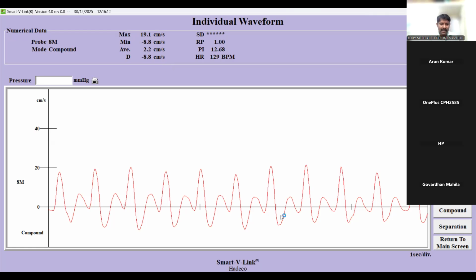Okay, so this is all about this agenda. I just wanted to keep the Doppler in hand and make you people informed about how to identify these three waveforms, and accordingly you inform your customer for better results in your regional sales and marketing of the products. The idea is to keep everyone informed how our Dopplers are clinically better, not cost wise. I'm telling you, clinically better, and how it will help them in treating and giving better patient care.